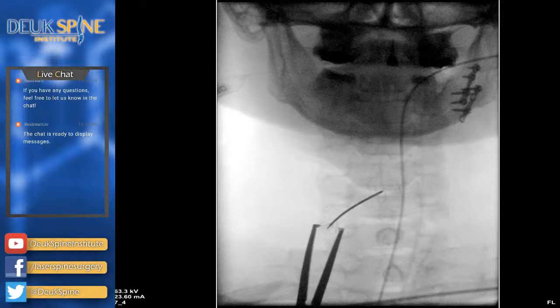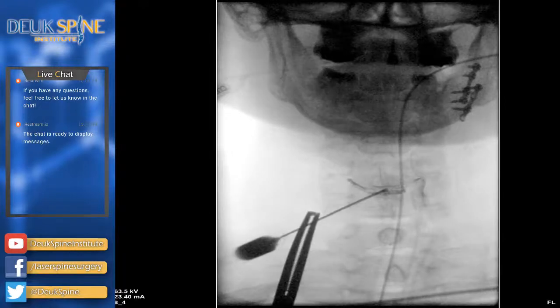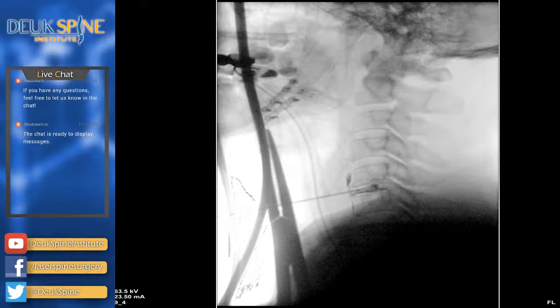Shot. Yeah, look at that. That is so cool. Save that. Look at the dye going down to the left around his nerve root. So it shows you the tear on the left side and the dye coming. Go to lateral while I'm talking, please. And it shows the dye shooting around the nerve root on the left. That is so cool because it's leaving the disc on both sides. He has a tear on both sides, but it's worse on the left, and you can see the dye just snaking around the nerve root there.